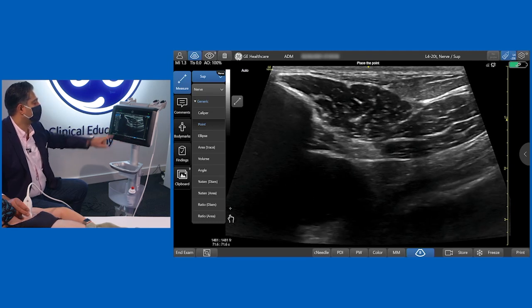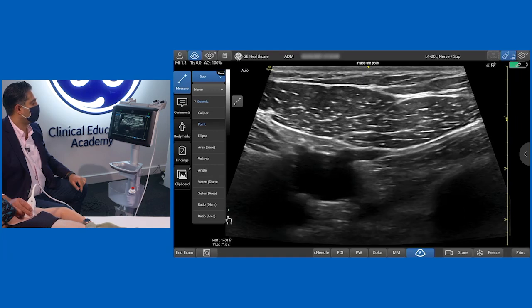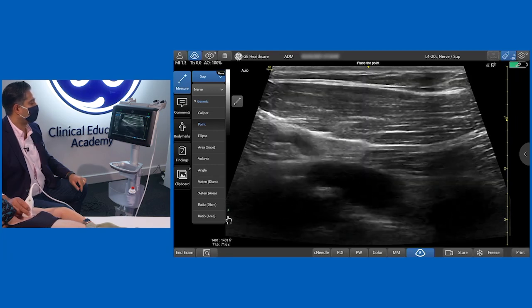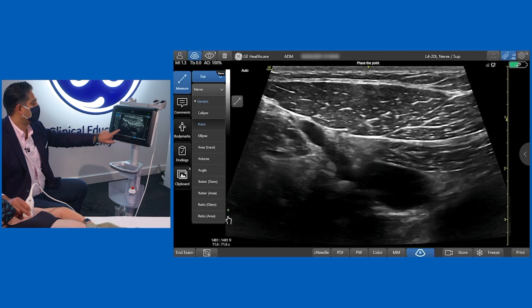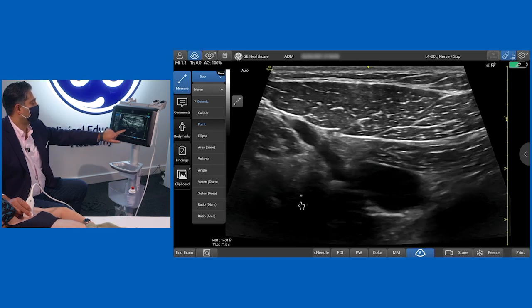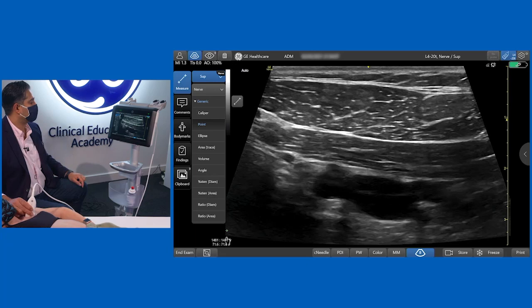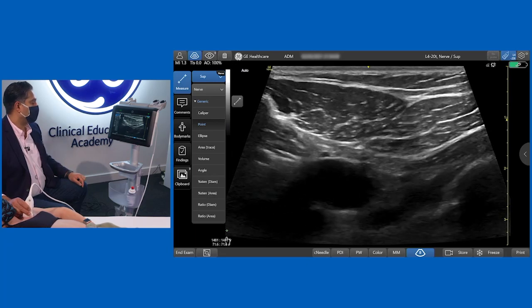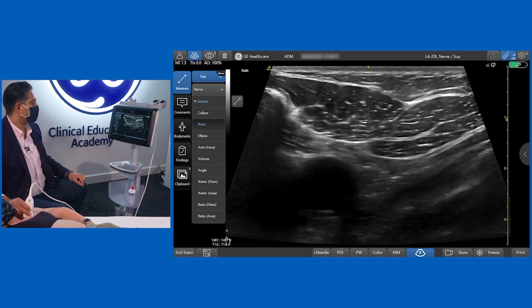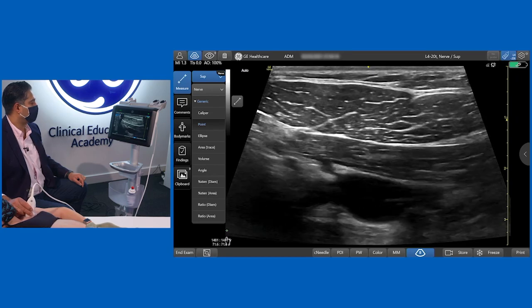As I slide the probe laterally, you're going to see the subclavian vein coming out and then it's giving off the cephalic vein right over here. So this is the cephalic vein coming up, and then deep to that you're going to see the axillary artery. The subclavian — it's actually the axillary vein at this point — giving off the cephalic vein.